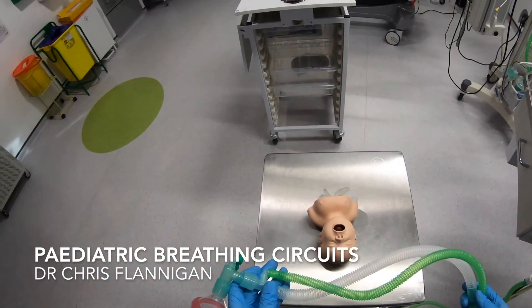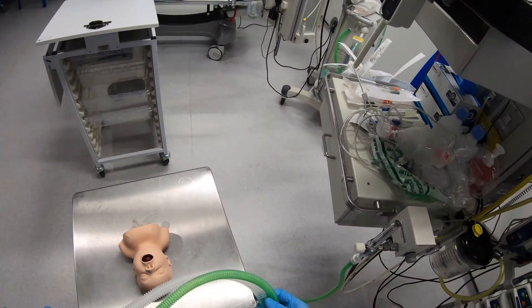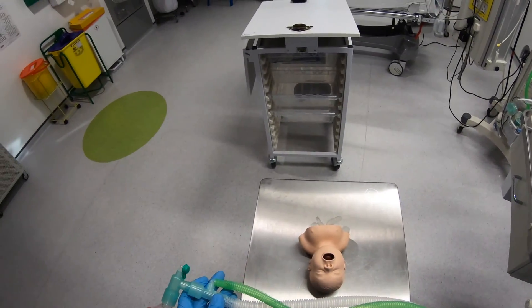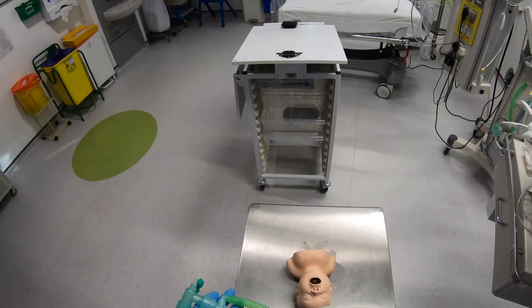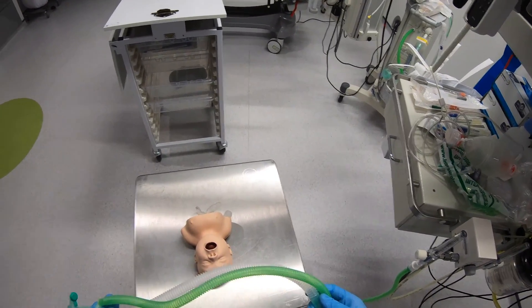Okay, so now I want to give you a run through some of the breathing circuits that we use. This first one we would use maybe up until about 25-30 kilos and this is called a Jackson-Reese modification of an Ayre's T-piece.